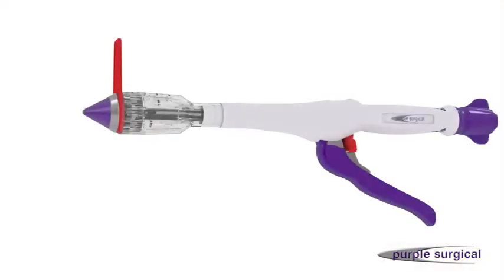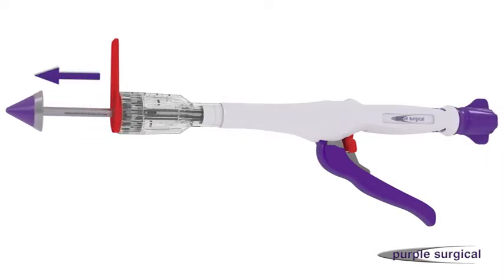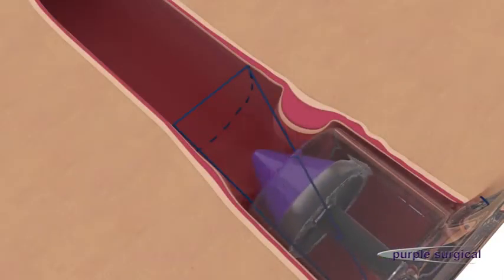Open the Purple Surgical Ultimate Hemorrhoidal Circular Stapler by fully turning the wingnut counterclockwise. Discard the red shipping wedge. Lubricate the anvil and transparent cartridge and introduce the anvil head beyond the purse string suture.